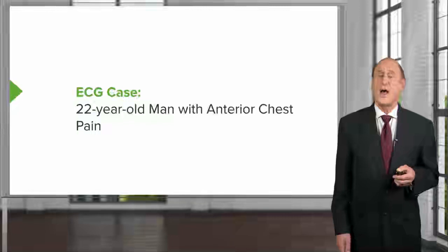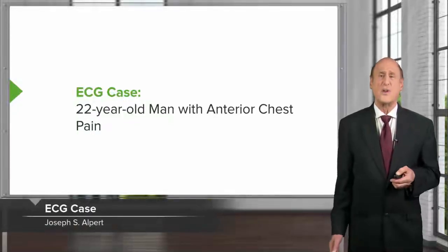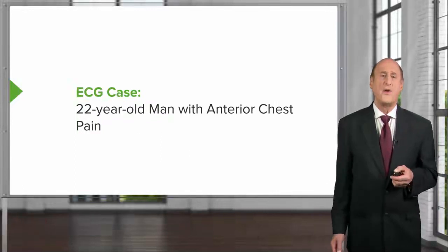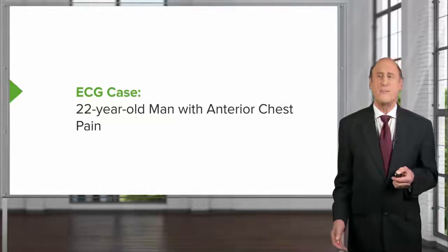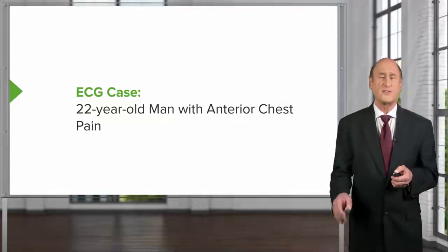Well, we've covered a lot of important definition material, and you may need to repeat this lecture a couple of times to make sure you have all of the numbers down, or you may have taken notes on that so you remember it. Once you start reading EKGs, it'll become easy to remember what the various intervals should be. Oh, the PR needs to be less than 5 little boxes and so forth.